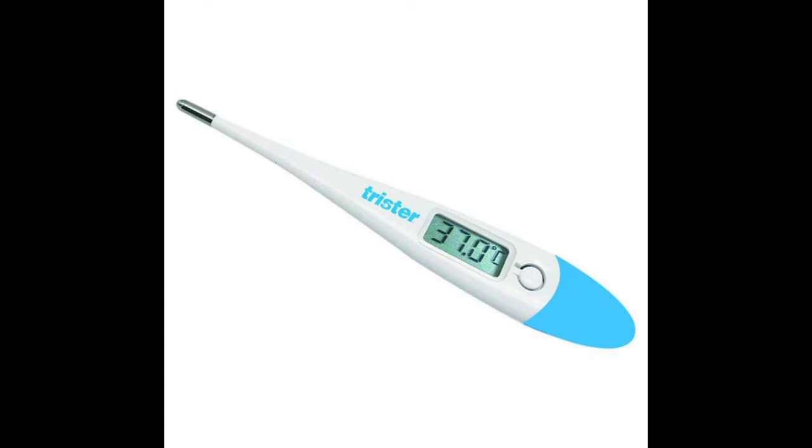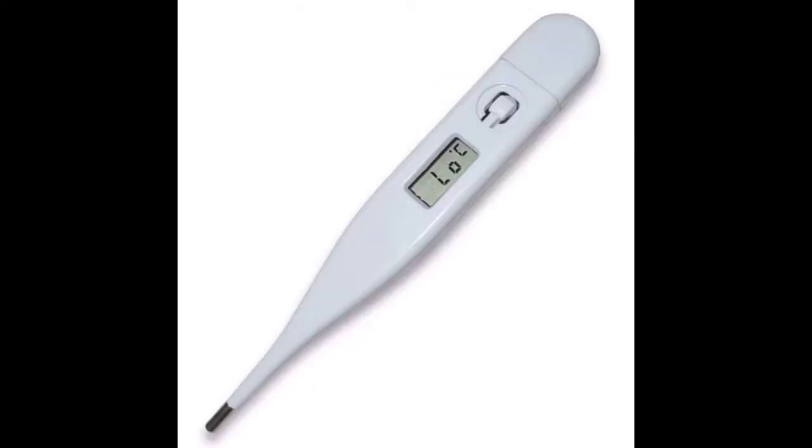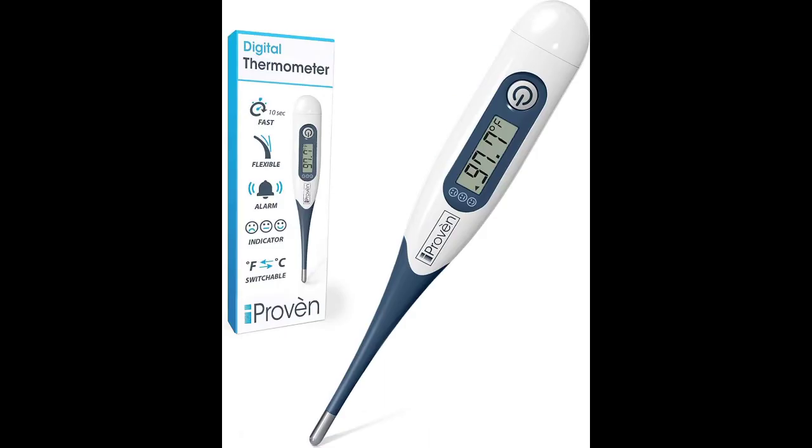A digital thermometer is used to take an oral temperature. It is a small handheld device with a window showing your temperature and numbers. It is easy to use and measures body temperature within seconds.